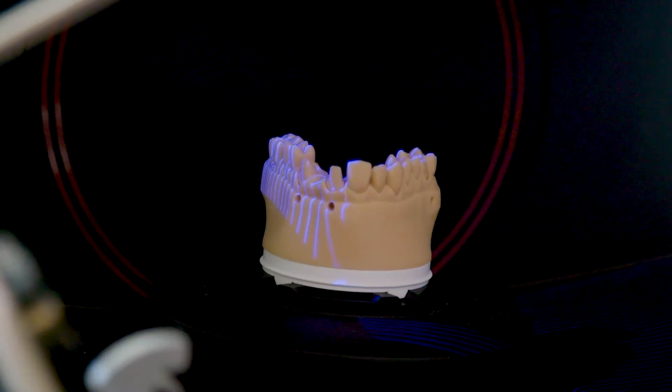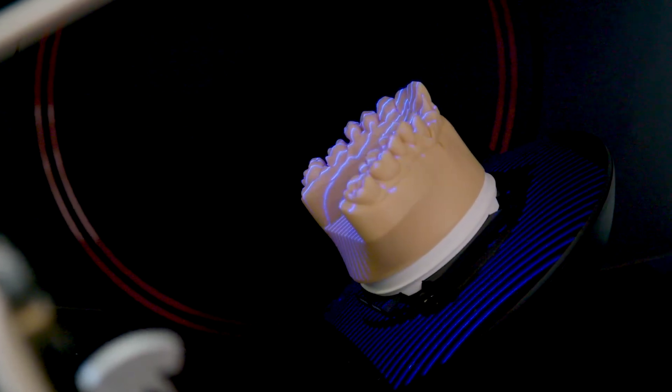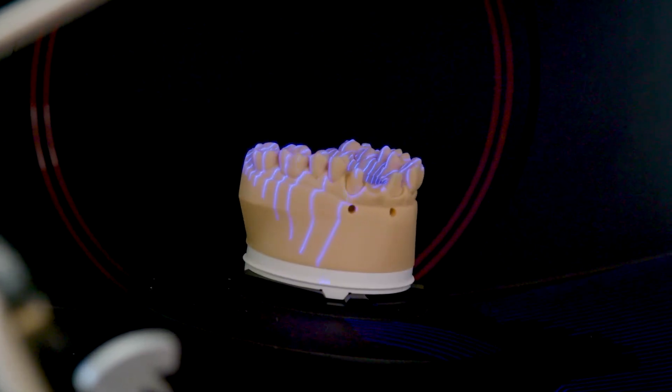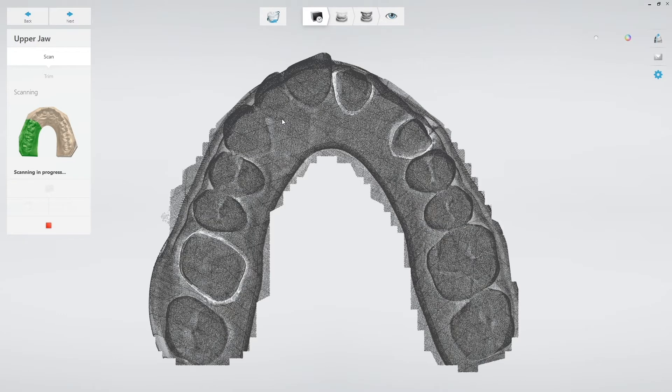It's going to do a detailed scan of the prep, and then at the end of those scans I'll show you how to place the articulator into the scanner with the accessories that you need for this. The e4 is our fastest scanner in the e-series portfolio.